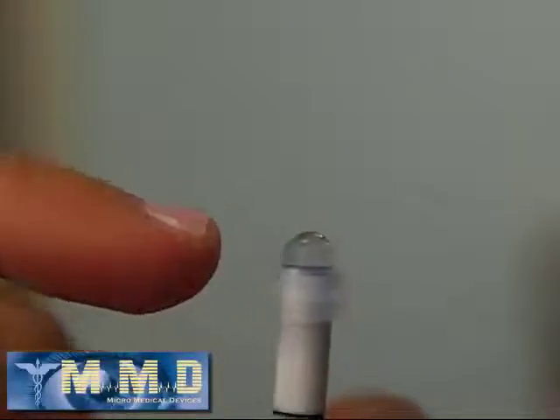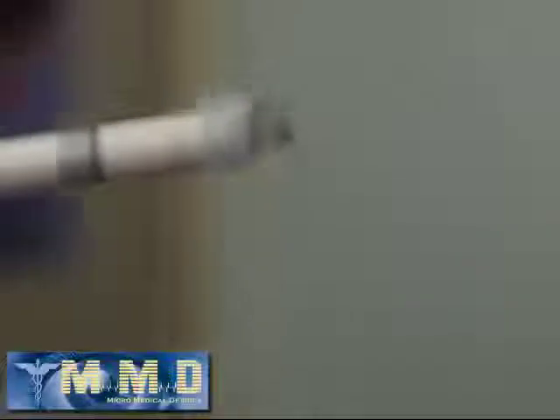I'd like to re-emphasize the proper amount of meniscus on the EZ Immersion Tip. And as you can see, the proper amount is just enough to have about a millimeter or 1.5 millimeter dome. You don't want to overflow the dome, because when you hold it in a horizontal position, if you have a dome that is too big, the dome will cause a prismatic effect on the LED light, and the patient might not be looking directly at the LED.